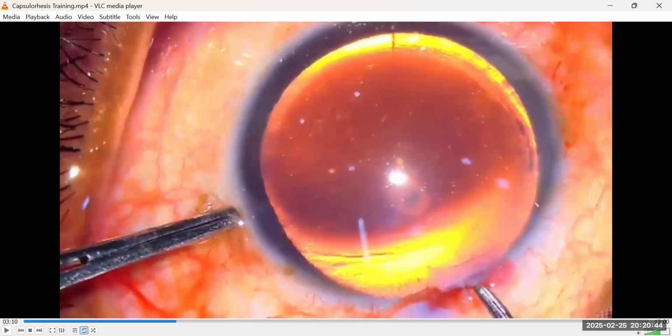All right, let me play back the video. Locate the center. Achieve a puncture as soon as possible. Great. Don't go to the periphery to achieve a puncture. Nudge a flap out that you can hold firmly. This is where, let me make my confession, this is where adrenaline starts surging on me when I am holding firmly.